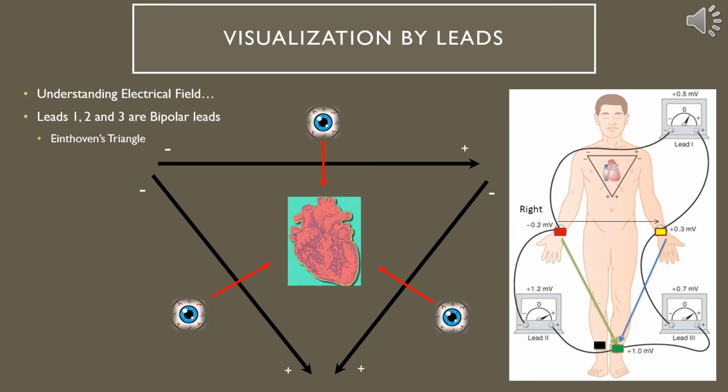When we are evaluating the patient's EKG rhythm, what we're seeing is the information that's relayed from this negative to positive lead, and it is sent to the EKG machine, and those opposing electrodes, the information that is gathered is interpreted by the EKG machine in the amplitude waves that are displayed on the EKG.